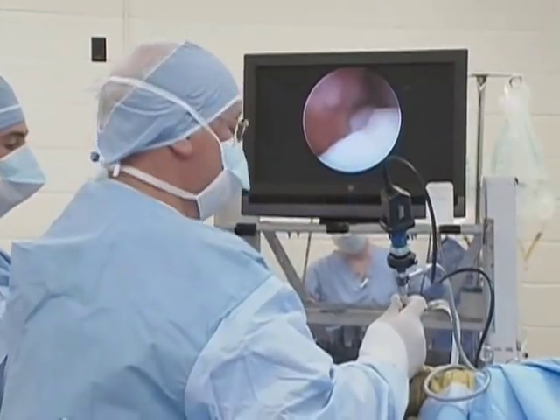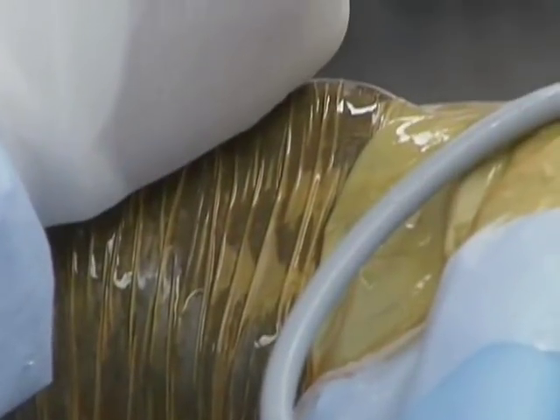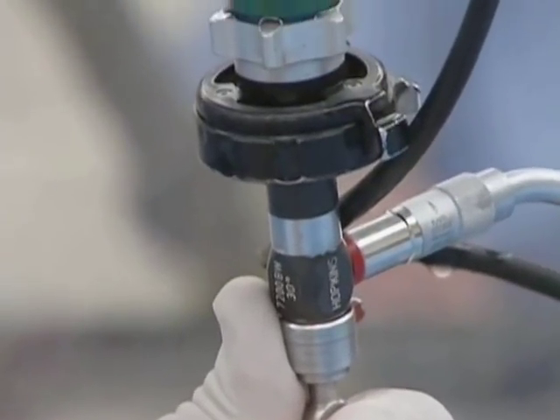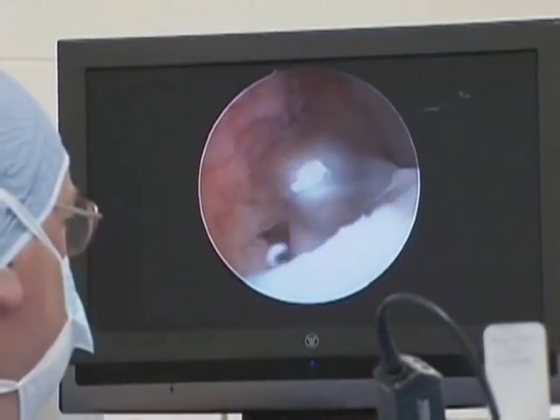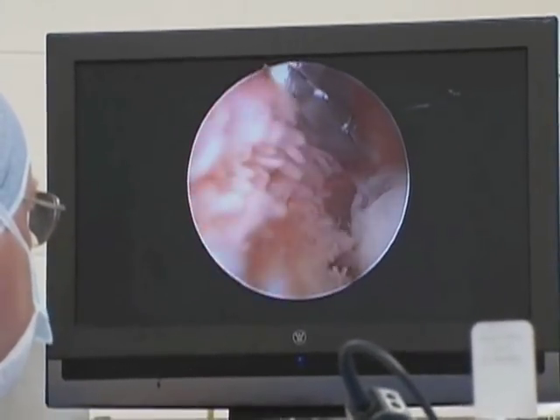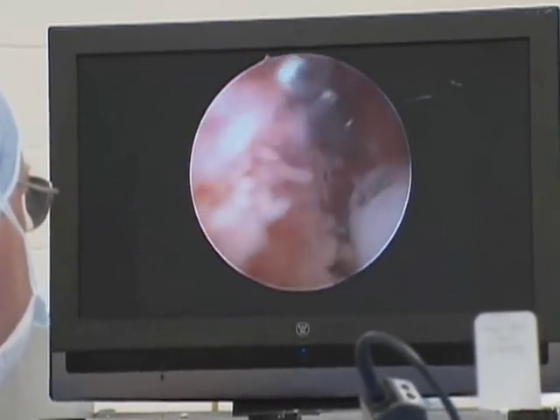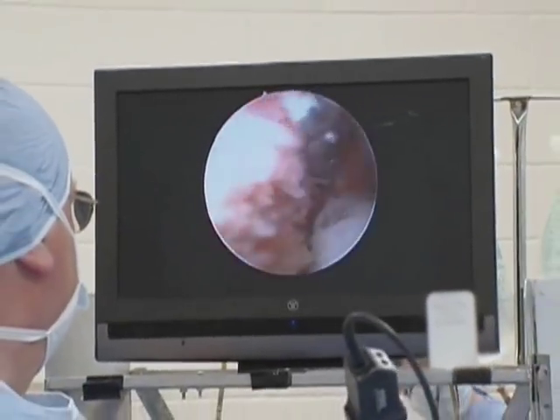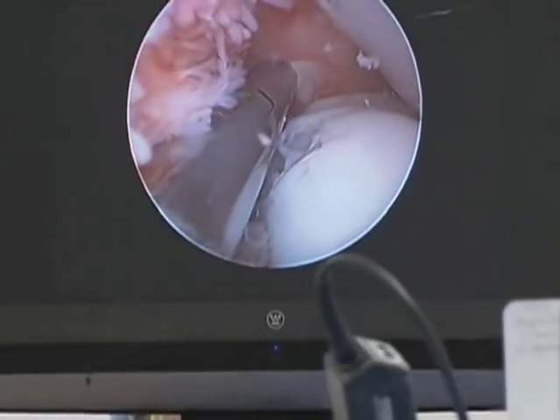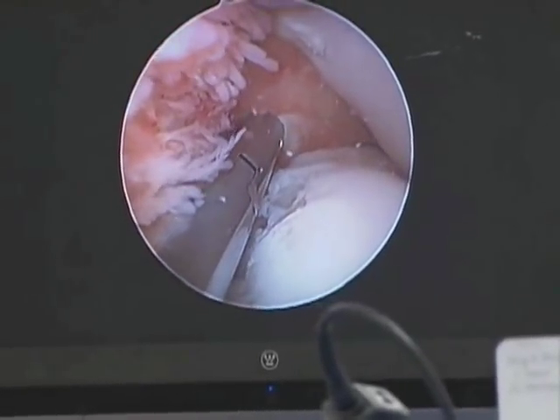Most people have the misconception that what actually hurts the horse is the chip inside the joint like a stone in your shoe, but that's rarely the case. What bothers the horse is this debris that I'm taking out now. See how pink those are? And they're swollen. They sort of look like fingers, and that's because they're taking this debris out of the joint that's coming from the side of these fragments.